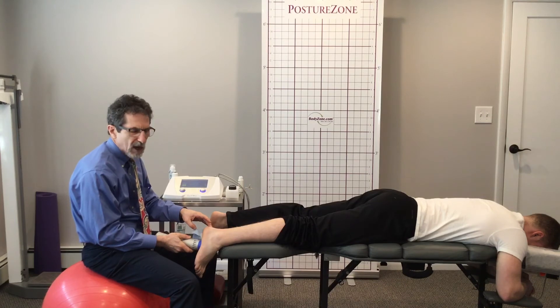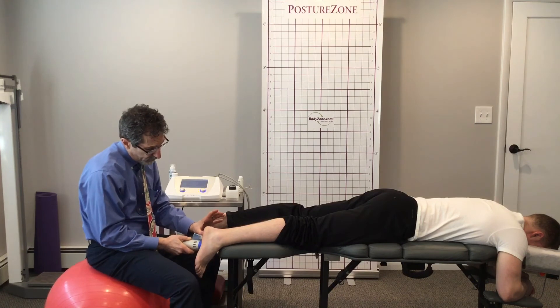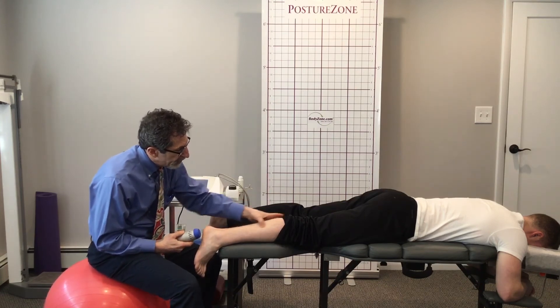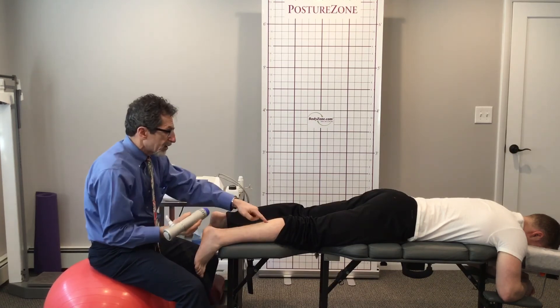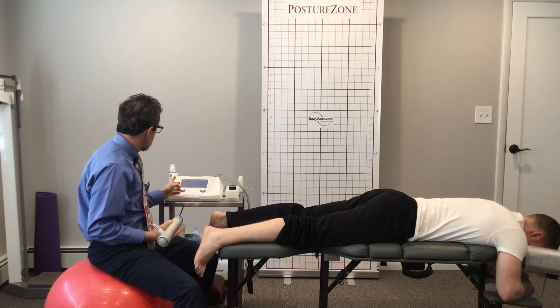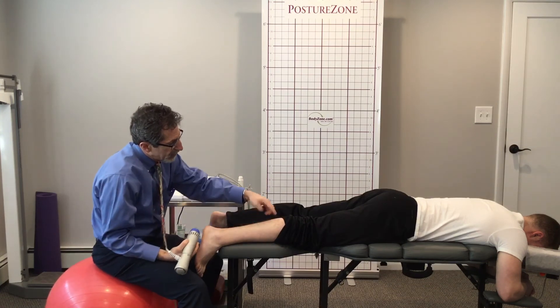The patient says: 'Oh wow, that doesn't feel so bad, doc.' Great — I'll stay there for maybe a thousand hits. If I put my finger where the inflammation is I can still feel that wave of motion coming in. So I'll do a couple of thousand hits through here. We put a little bit of conductant on — there's some on the radial head still. Then we can do the gastroc, which is much thicker tissue. I'm still going to keep the frequency at 20 Hertz but now I'm going to bring it up to about 90 millijoules, which gives more authority on the deep path.